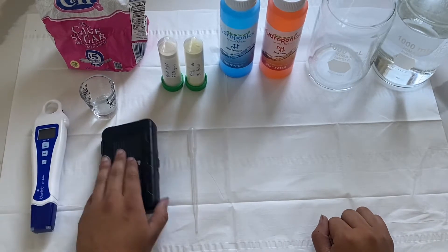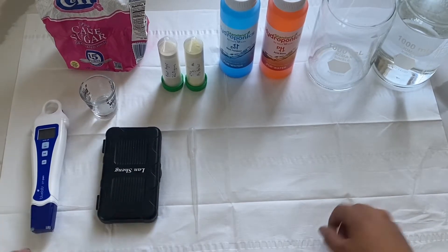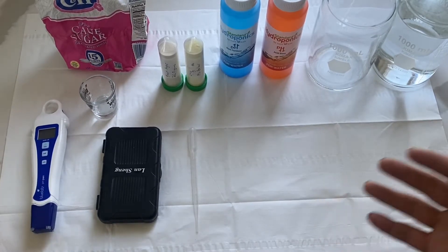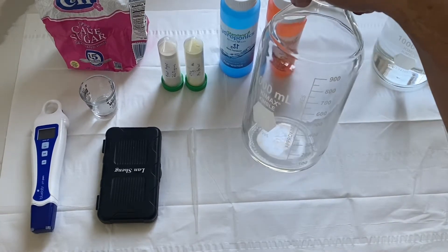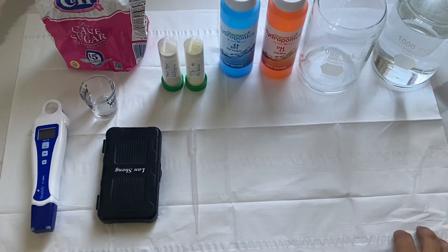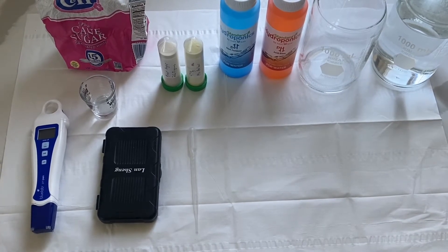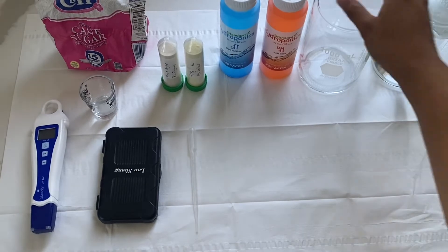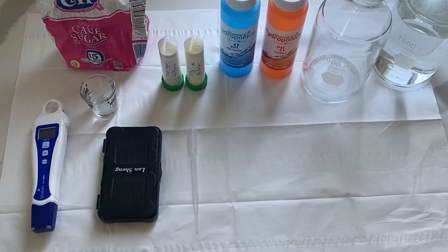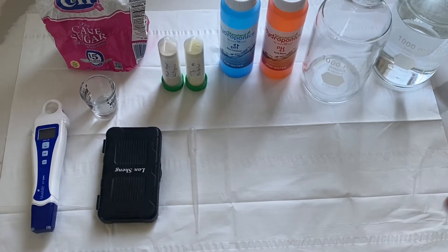We have a pH meter and a scale, because we need to weigh the ingredients and then pH the final solution. I'm going to be making a recipe for half a liter. I have a media bottle — you can also use a mason jar as long as you have a plastic or metal lid. This method we're going to do with a microwave, so there's no need for an autoclave or a pressure cooker. This can just be done in your microwave, as long as it fits the bottle.